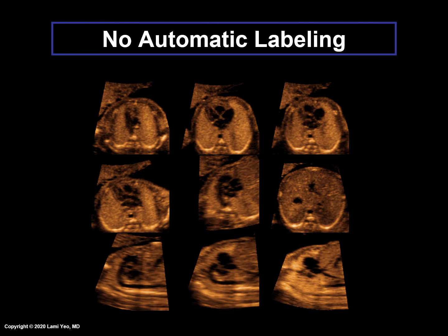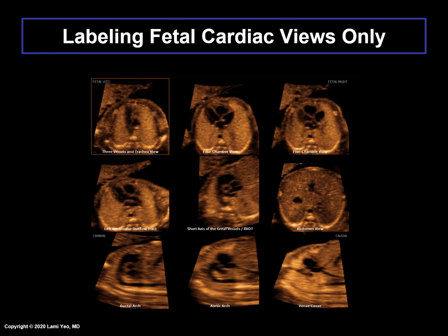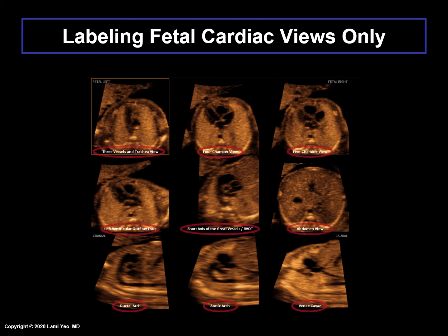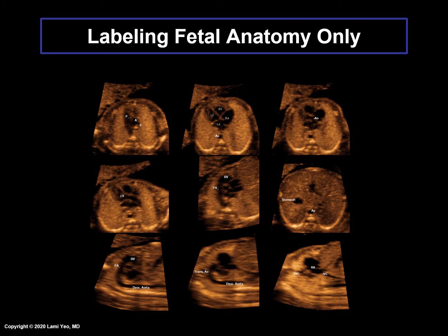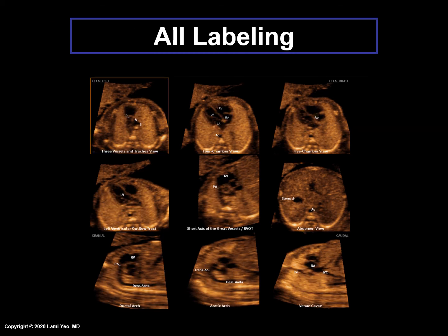Here is an example of the nine cardiac diagnostic planes with no automatic labeling shown. In this next example, only the fetal left and right sides, cranial and caudal ends, and fetal cardiac views are labeled. Automatic labeling of fetal anatomy only is shown here. And finally, here is an example of all automatic labeling performed by FINE.